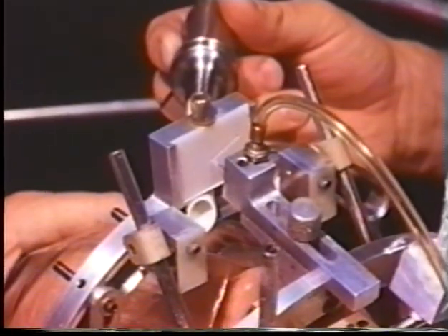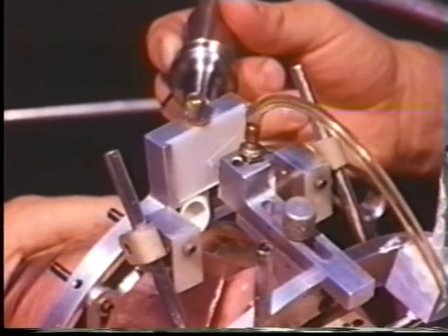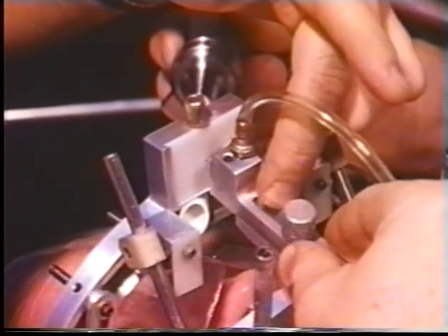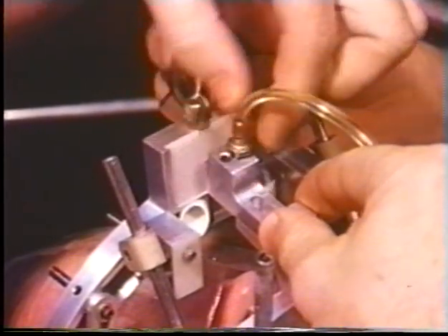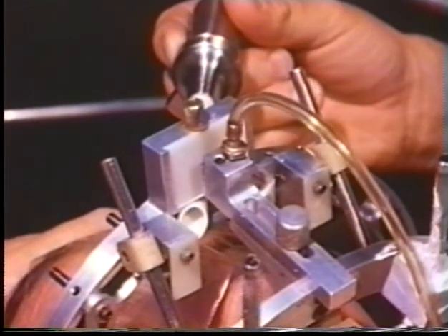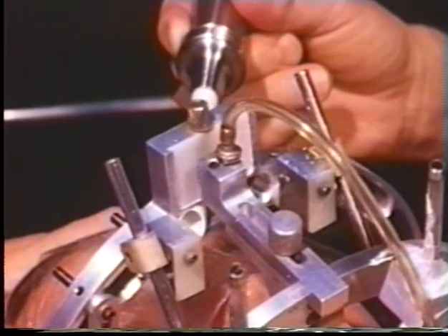The mandible is retruded to centric relation and the drill reinserted into the recording block the same depth as before. The right lateral recording is accomplished by having the subject move his mandible slowly to the right while the drill cuts the pathway.